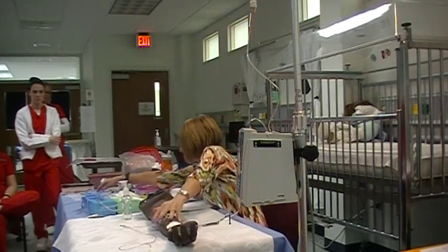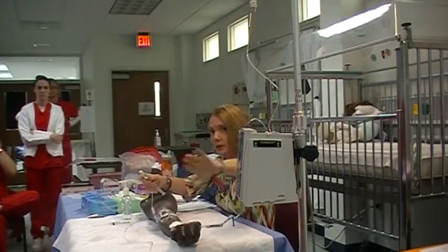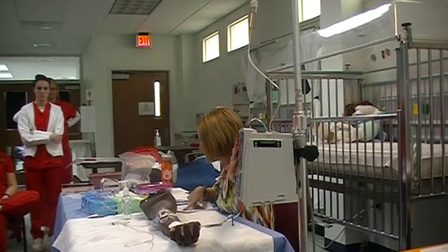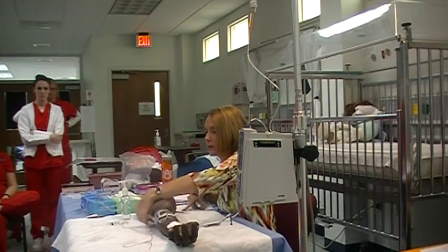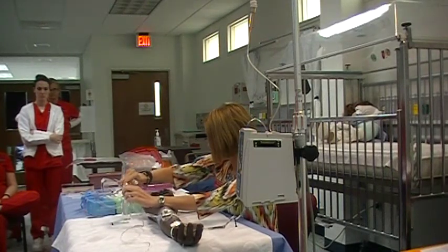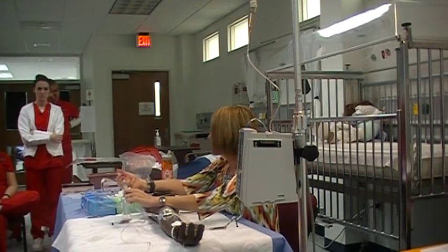So we have this here. We're already on an existing line, you're going to stop your pump. So let's go down to existing line, and we'll say that it's compatible. So we select the injection port closest to the patient. We're going to clean this port with our alcohol that we brought into the room. And then we're going to make sure that the IV is patent.